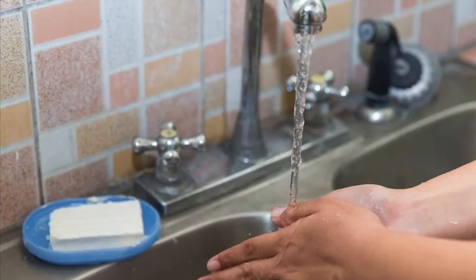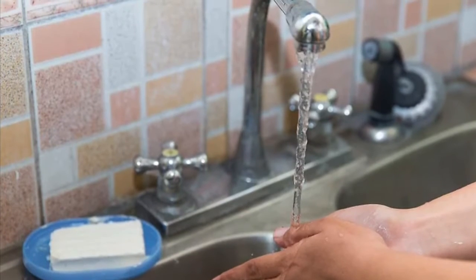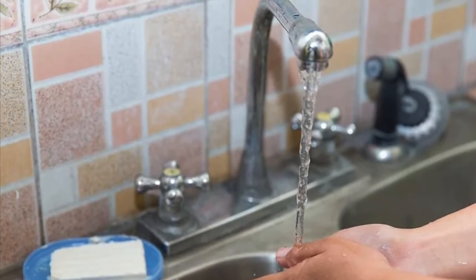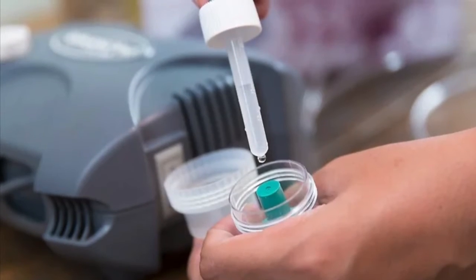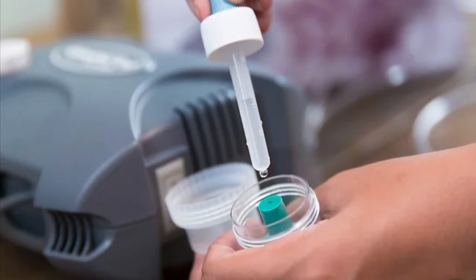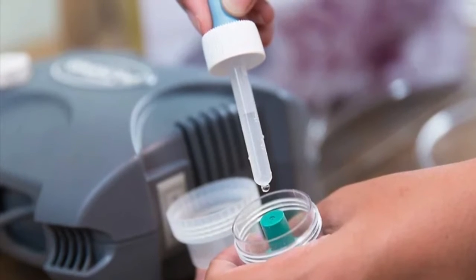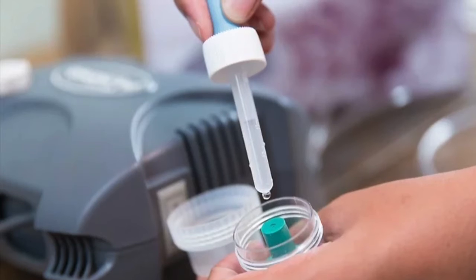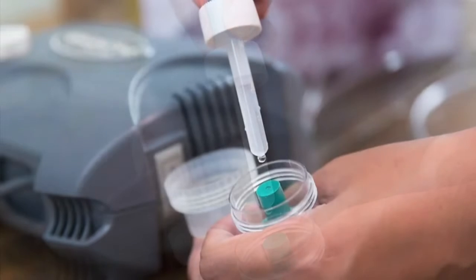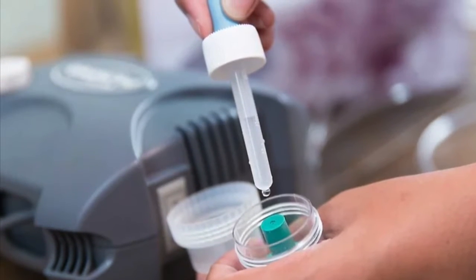First is to wash our hands to reduce microorganisms or prevent transmission of pathogens. And the second step is to place the medication into the nebulizer. Medications that can be put in the nebulizer include inhaled beta agonists and anticholinergics, inhaled glucocorticoids, and inhaled antibiotics.